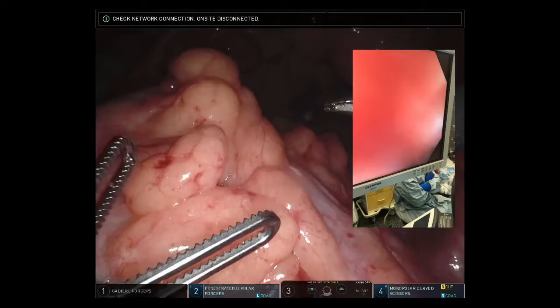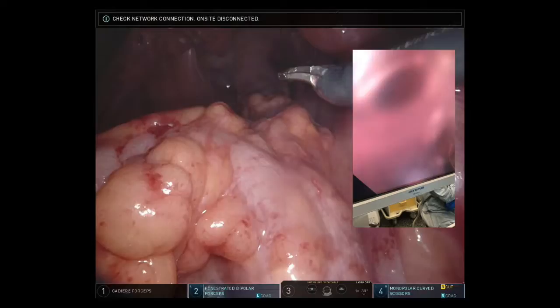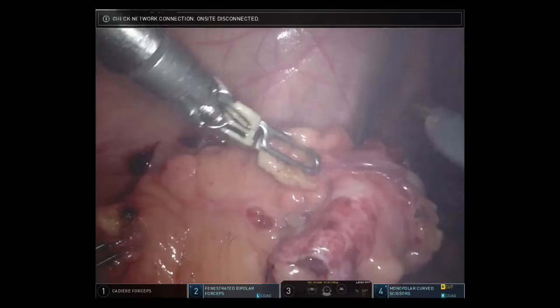As we passed the endoscope more proximally, we did enter an area where there was either diversion colitis or was in fact the site of the prior injury to the bowel that necessitated the need for the Hartmann's procedure. Given these findings, we elected to perform a segmental resection of the sigmoid colon to ensure that the anastomosis was performed to bowel that was healthy and viable.